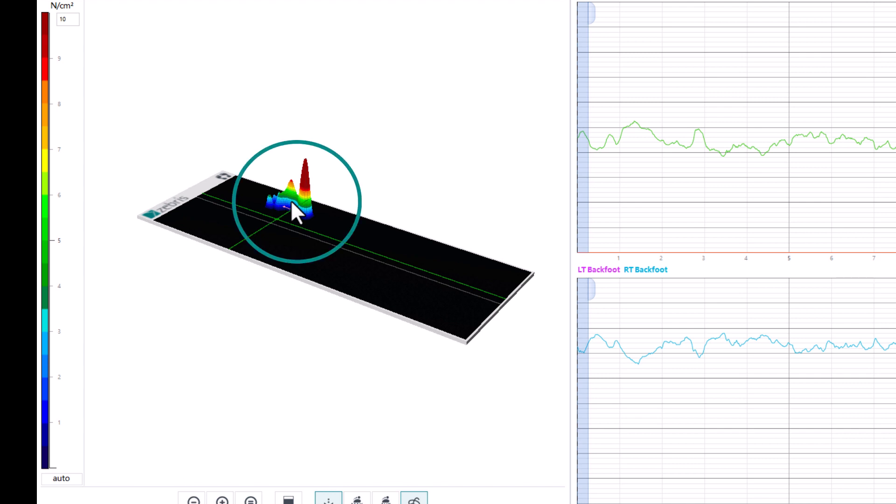On the one hand, the maximum pressure value can be set by entering a value in the upper field. This only applies to this measurement, and only whole numbers are allowed.